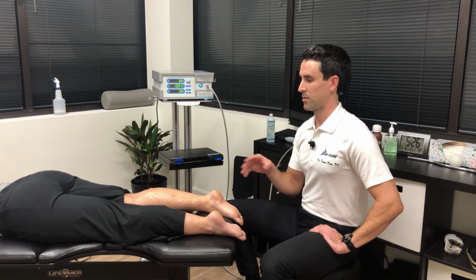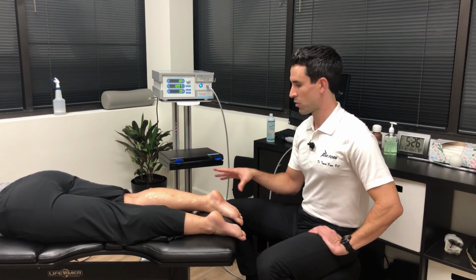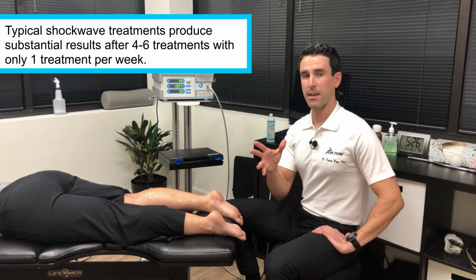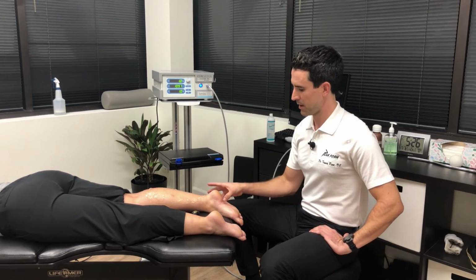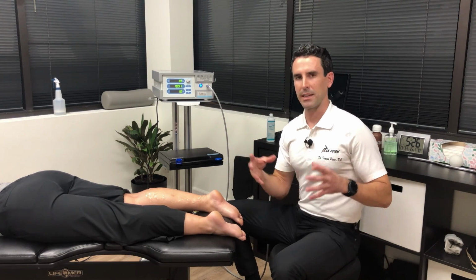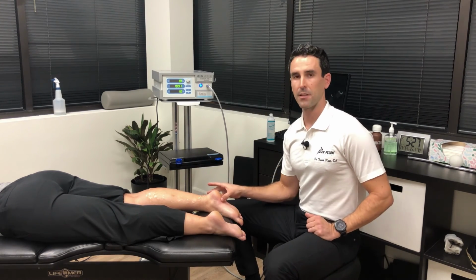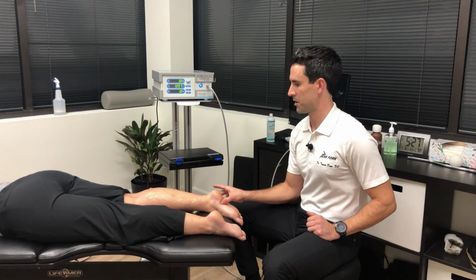And these treatments, the protocol is anywhere from about 4 to 6 visits, 1 time a week. And it's just real quick, about 10 minutes worth of this shockwave type therapy. And then after the 4 to 6 treatments, we wait an additional 4 to 6 weeks because of those cellular effects that the sound waves produce. There's what's known as an afterburn effect to the treatments, where after that last treatment there's still a lot of cellular mechanisms going on, regenerating in the area that helps a lot with the complete recovery of the condition.